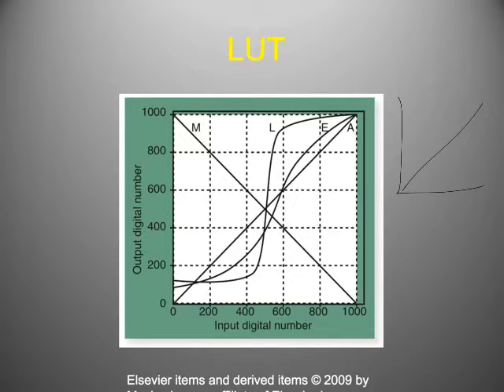This is not really helpful because this image would be very, very flat. There would be an equal number of whites and blacks on the image. It would be a uniformly gray image. The lookup table then artificially creates contrast.